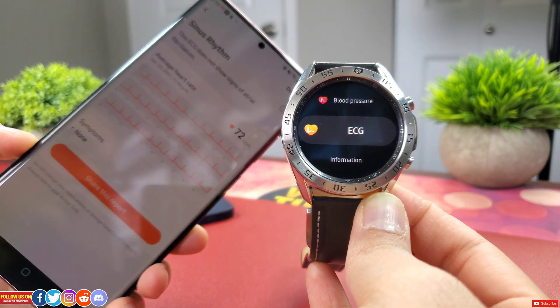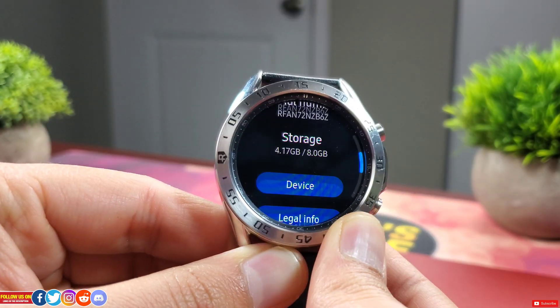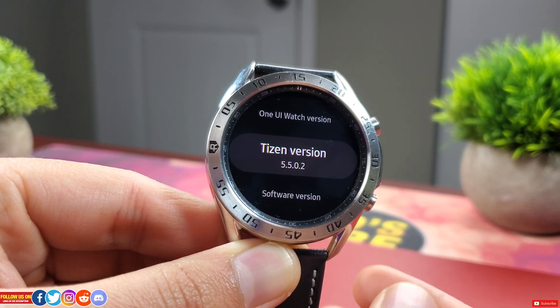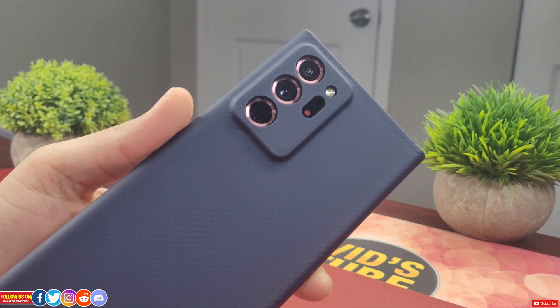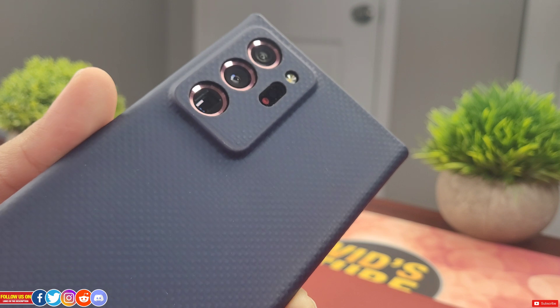For this video, my watch is paired with the Galaxy Note 20 Ultra. My Galaxy Watch 3 is running on Tizen 5.5.0.2, so make sure your watch is running this version or higher. If you have tried this on your watch when it's paired with other smartphones other than Samsung, please comment down below so it can help out others.